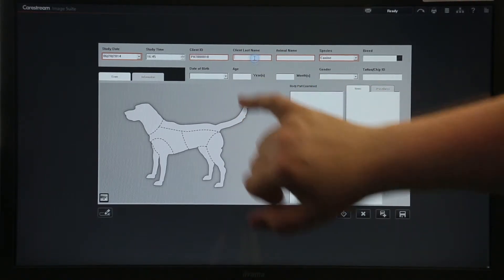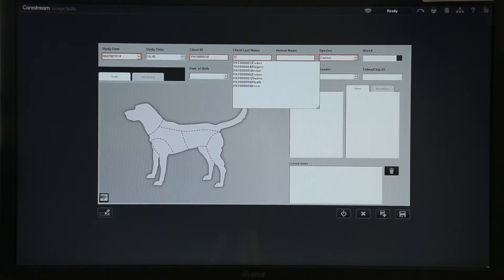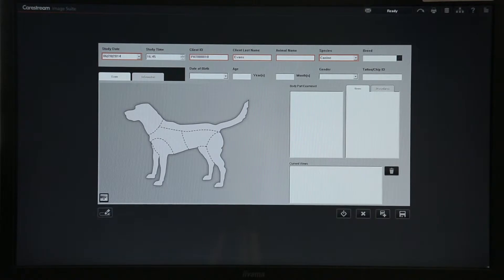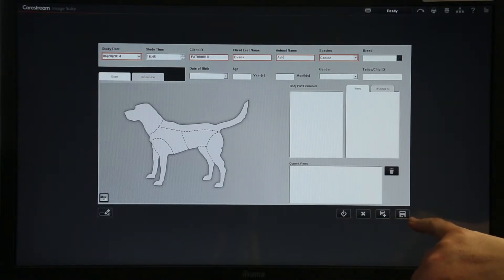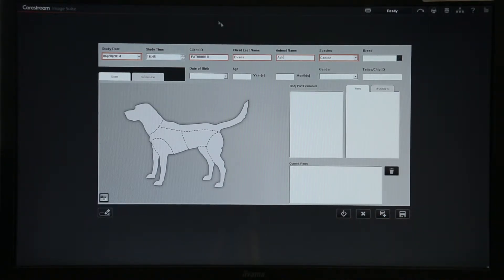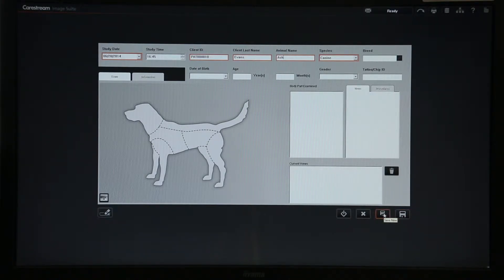Then if you want to input your client name you can do so, and you can tab between the boxes to move around easily, then input the patient's name. You have four options along the bottom: Start enables you to go into the patient; Save enables you to save this patient and go back to the worklist; Save and New saves this patient and clears the box ready for you to input another patient; and Cancel will cancel out of the patient.